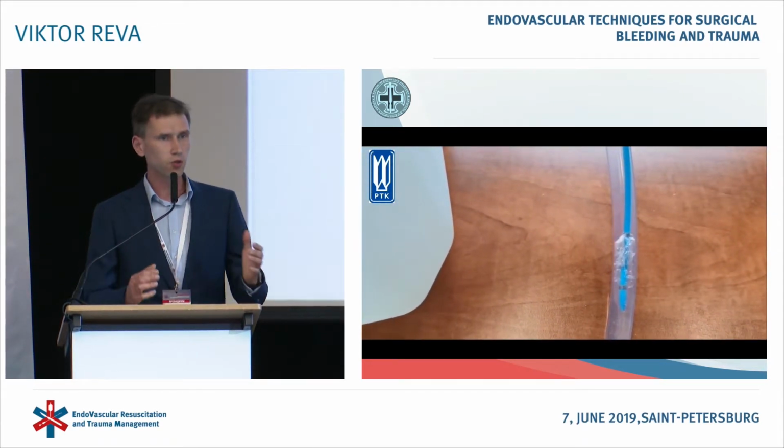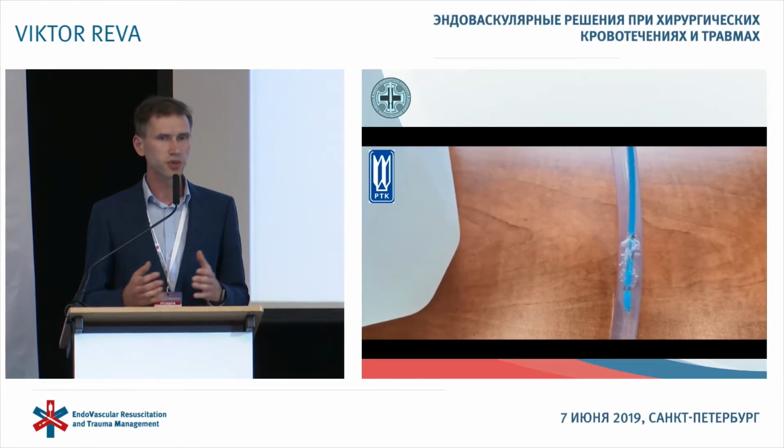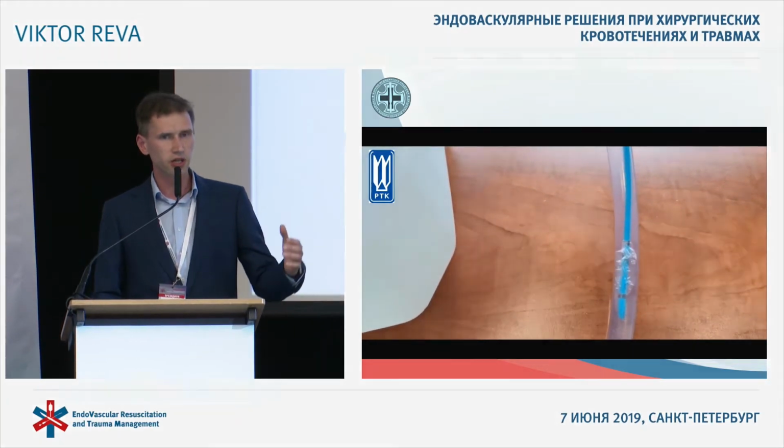In conclusion, we promote these technologies, but Rebo per se does not save the life of the patient. It is only a bridge to reasonable surgery, to hemostasis, and it is not worthwhile to introduce balloon occlusion per se. It is part of a concept how to manage wounded and traumatized patients in the 21st century based on the EVTM principles. Thank you.